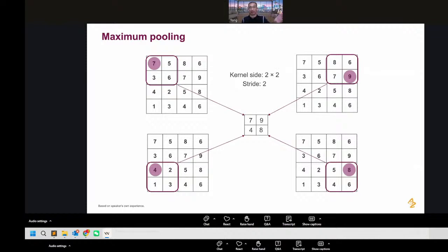So you see here, from the previous bigger matrix of the whole slide, we go down to this 4-value matrix. This is the concept: extracting all the features from the original image or input layer, and simplifying while still containing the most critical elements.